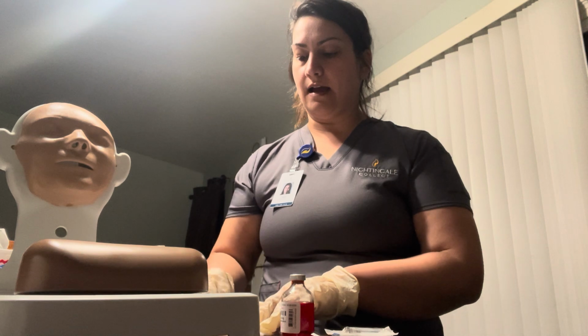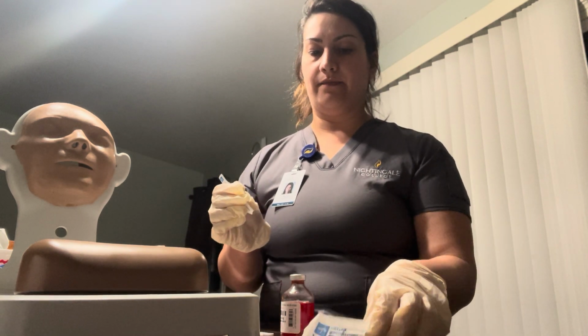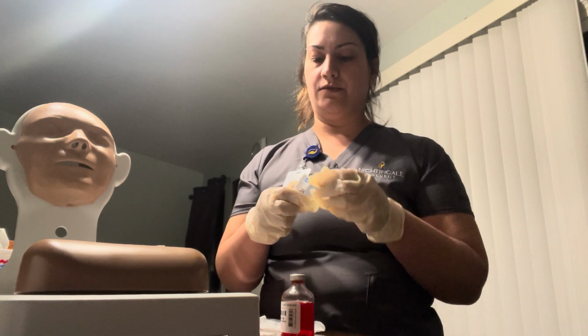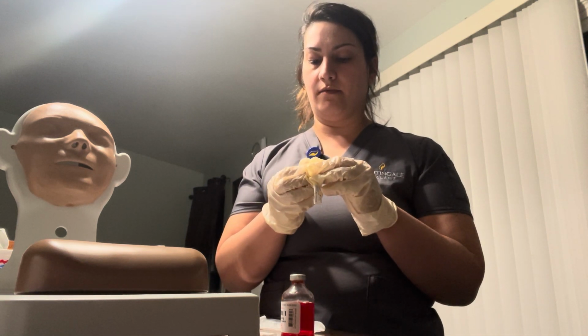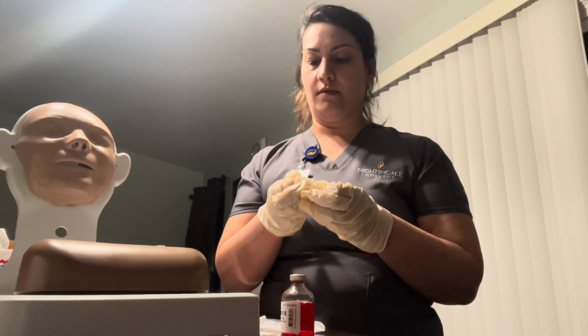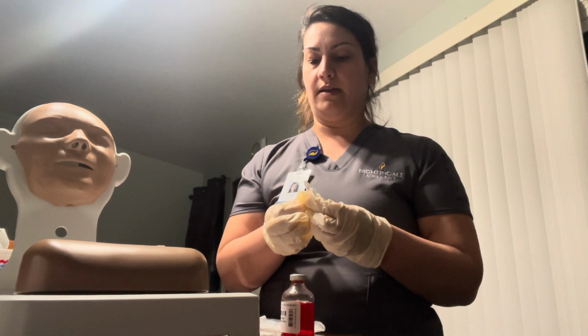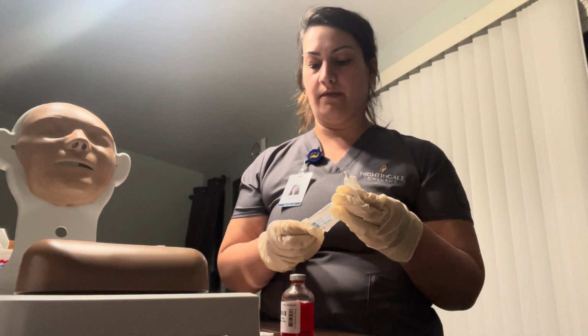Next, I'm going to put my needle onto the syringe. I will open it. Make sure I don't touch it. Be as sanitary as possible.